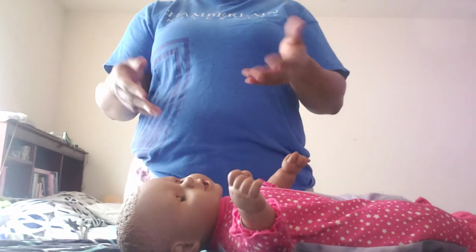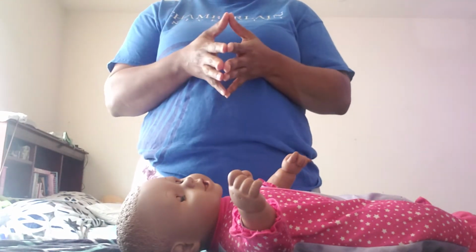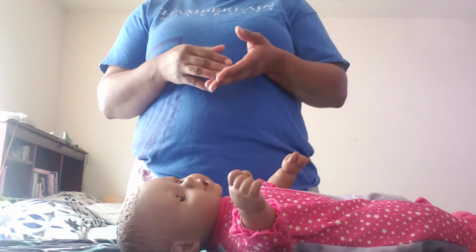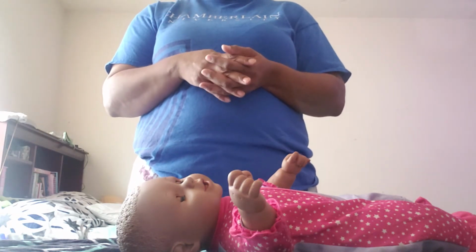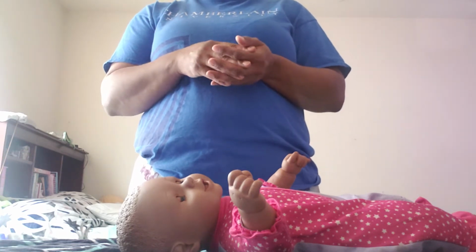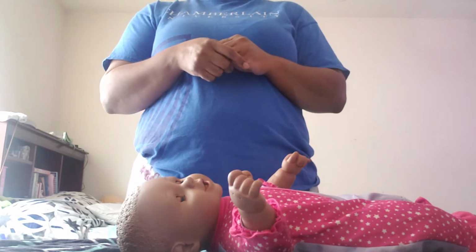Then I go in and introduce myself. Hi, my name is Deanna. I'll be your nurse for today. Can you please state your name and your date of birth? Okay, great. I will provide the patient with some privacy, and I'm just coming in to verify the orders of an NG tube placement from the physician and the removal of the NG tube.